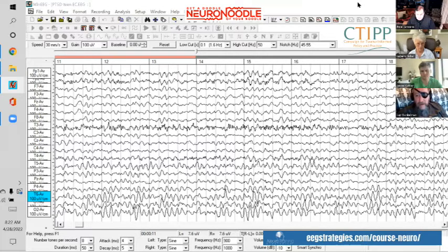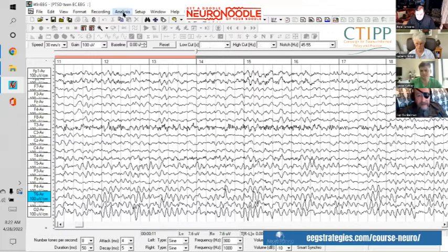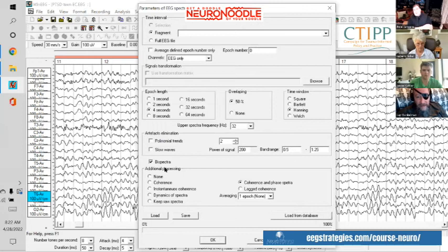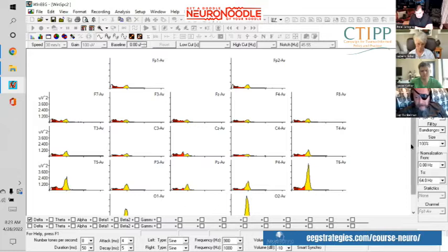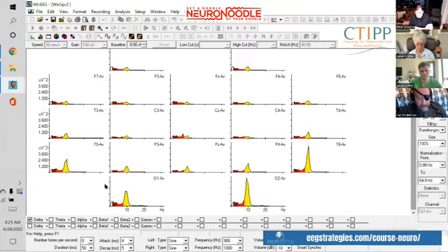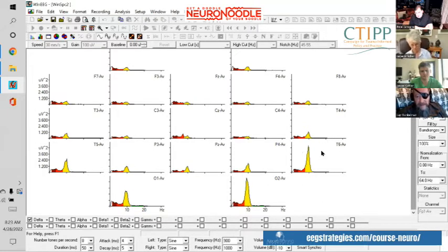Neurofeedback can fix that. What I need to do is essentially create a set of maps of this data, because wiggly lines don't mean that much to a lot of people. We're going to colorize this with traditional band ranges. The alpha band is a normal background rhythm at the back of the head — you should see alpha at O1, O2, and PZ. Alpha is at 10 hertz here. This is an extremely aberrant amount of resting state. The spot that's supposed to perceive emotion and social interaction is essentially idled.